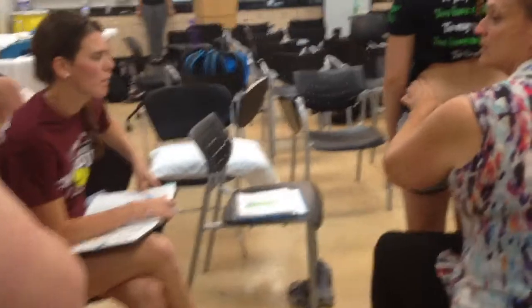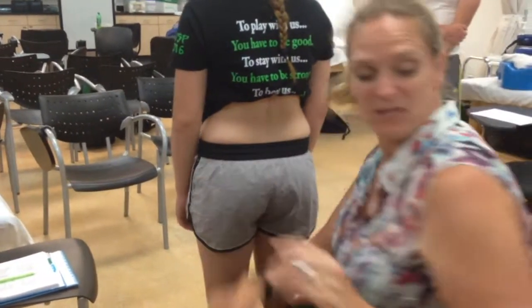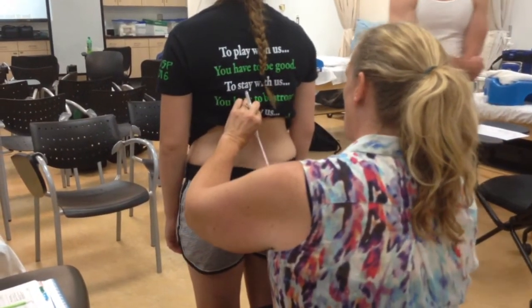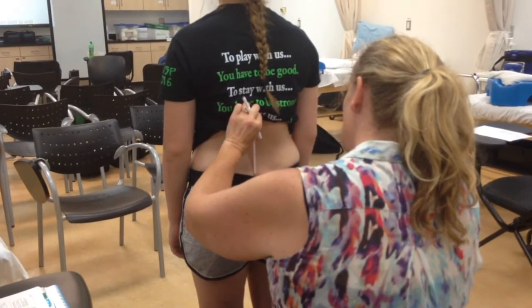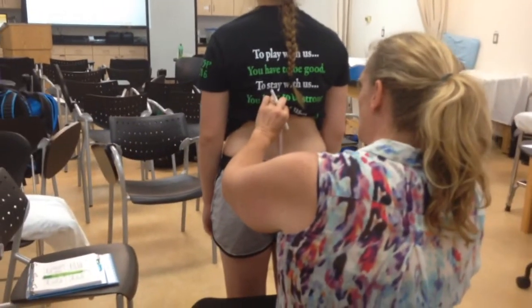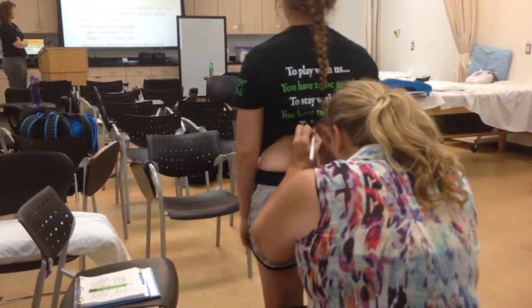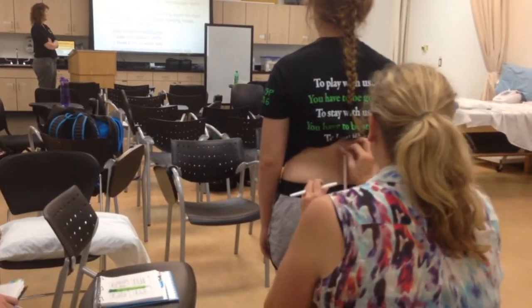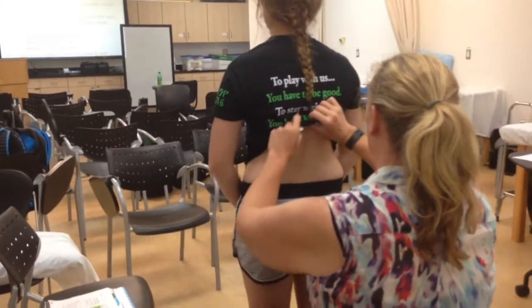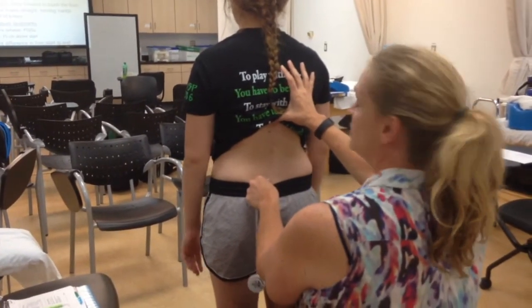I'm going to mark here because they don't have their body pen. And then you're going to mark 15 centimeters up. Let the tape go however it does — it does not need to stay tight to the skin. Maddie has a normal lordosis, so it's not tight to the skin. The bottom mark is the PSISs, and the top is 15 centimeters proximal. I've got a mark here and a mark there — that distance with her standing up straight is 15 centimeters.